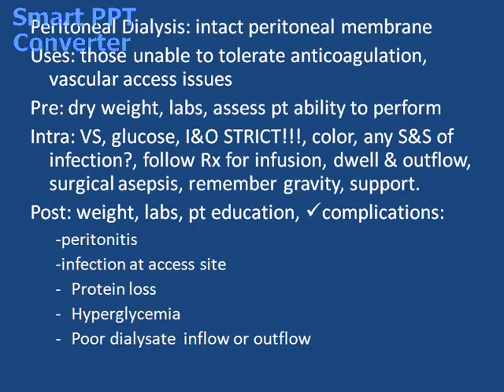During the procedure, we're going to monitor their vital signs during the initial dialysis of clients in the hospital. If they come into the hospital and they are on peritoneal dialysis, they are very, very fussy, and they should be, as to how this is done. So if you're uncomfortable at all in doing this, make sure you have someone there who has done it before, and listen to what the patient has to tell you.